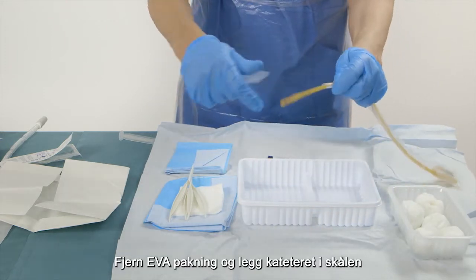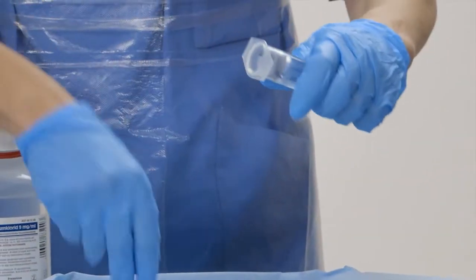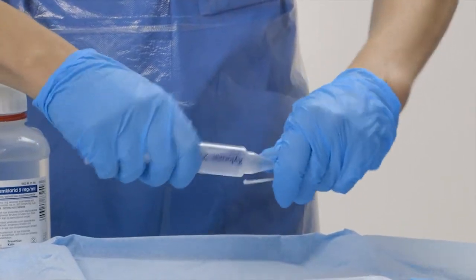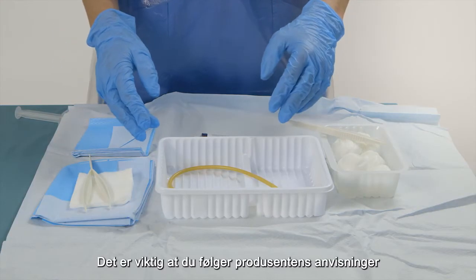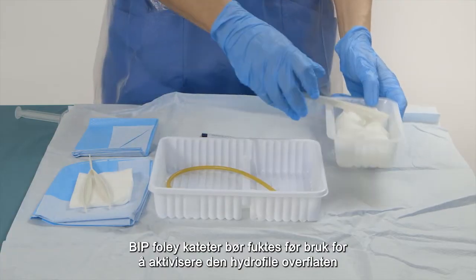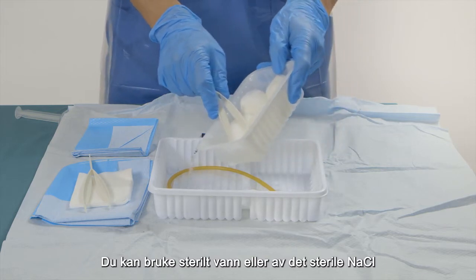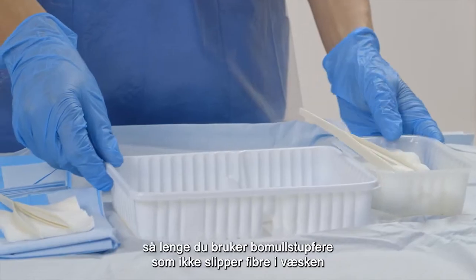Remove the EVA bag and place the catheter into the tray. Prepare the anesthetic catheter gel syringe. It is important to follow the producer's instructions. The BIP Foley catheter should be pre-wetted to activate the hydrophilic coating. You can use sterile water or some of the sodium chloride for this, as long as you use cotton pads that don't release any fibers into the liquid.